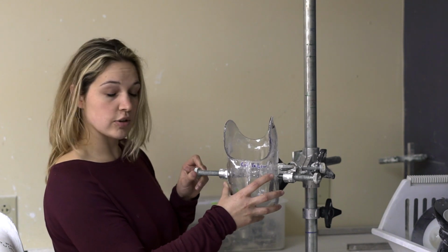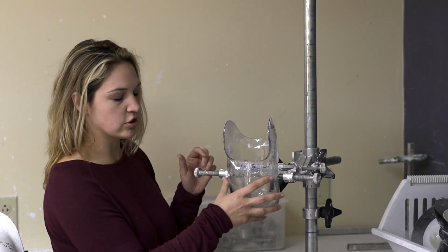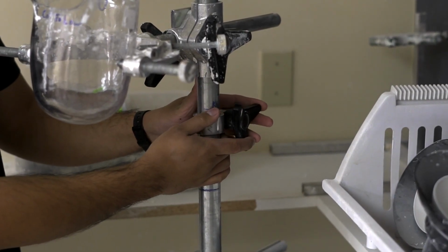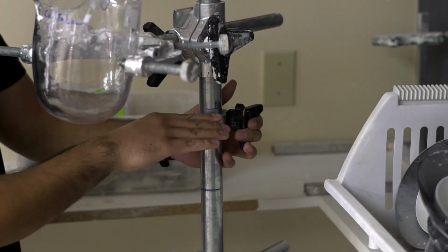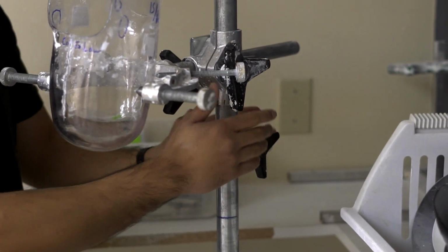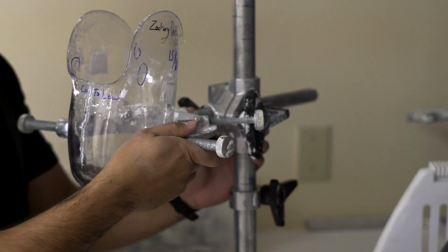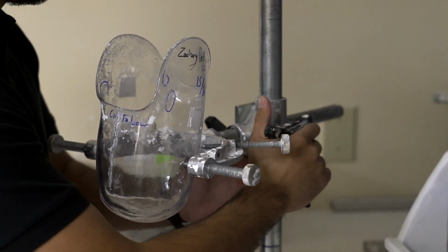And then Johnny over here is going to explain how you would adjust it for knee flexion, extension, or whatever you're going for. This is the height locking collar, and you set this to how high you want your pylon to be, and it stops this check socket from going lower. And then this is where you adjust the height of the check socket crown. Move it up, move it down, and you set it right there onto the height locking collar.